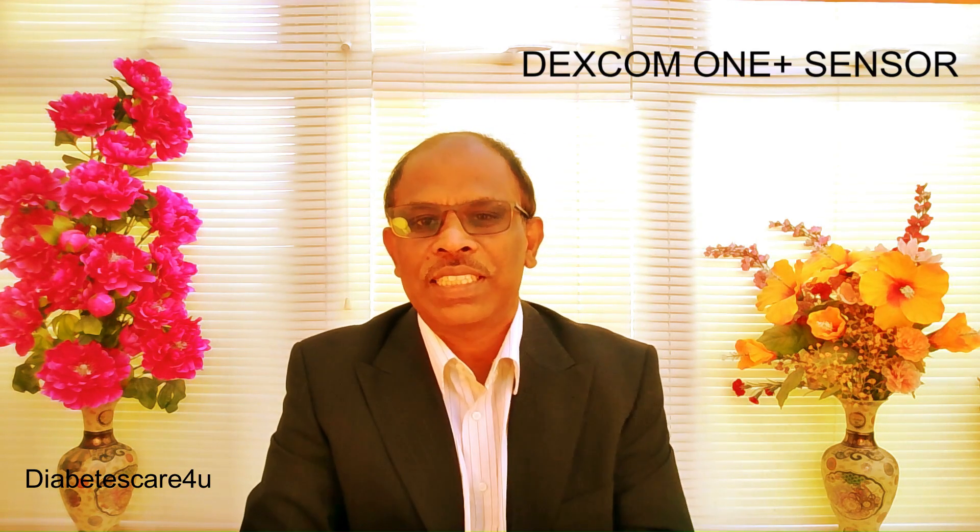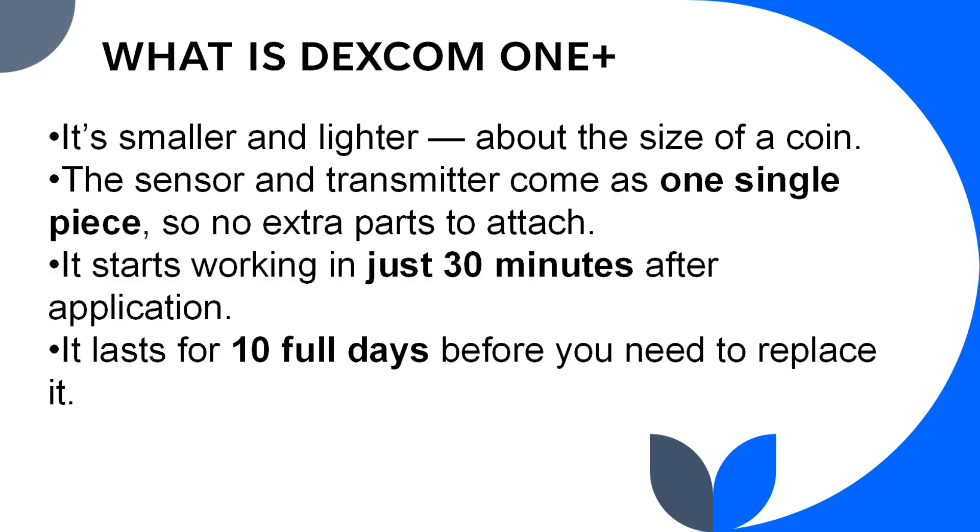So what is the Dexcom ONE+? The Dexcom ONE+ is the latest version of the Dexcom continuous glucose monitoring system, and it is much easier to use than older versions. Here is the reader. What's new? It is smaller and lighter, about the size of a coin. The sensor and transmitter come as one single piece — no extra parts. It starts working in just 30 minutes after application, compared to two hours for the older version, and it lasts for 10 days.